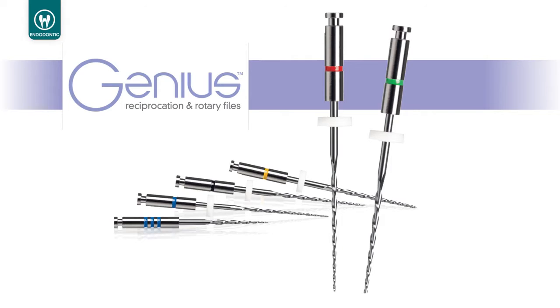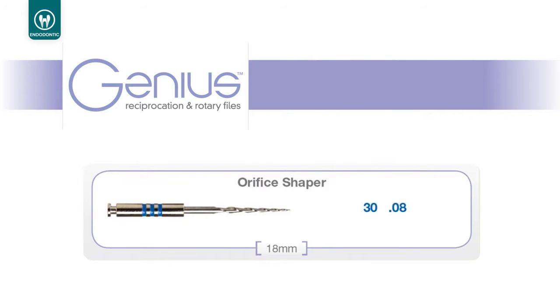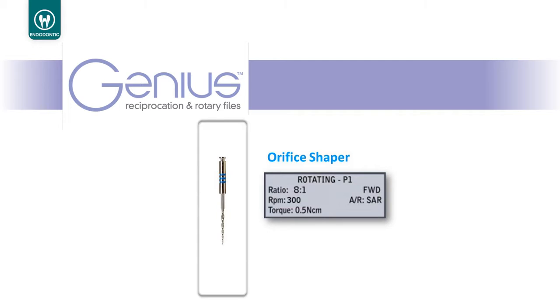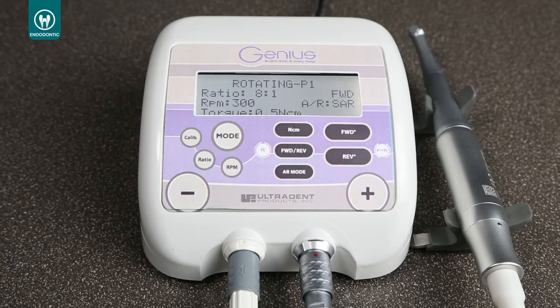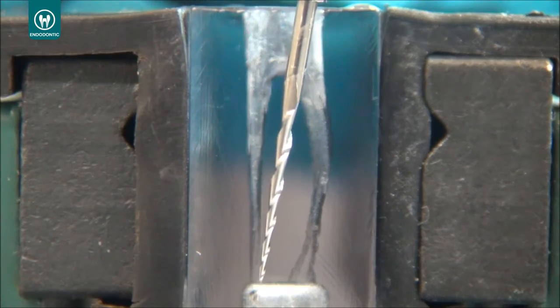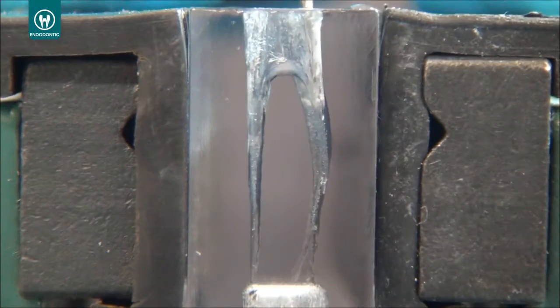This is a Genius acrylic block. It's made with an image of a molar inside, and this image is from a micro CT of a real molar that was reconstructed by a 3D printer. So the orifice shaper is a 30.08 file, and we use it in rotation. So first we have to turn on the motor and be sure that it is in rotation P1. The orifice shaper has an S cross-section as well. It means that this file cuts a lot.